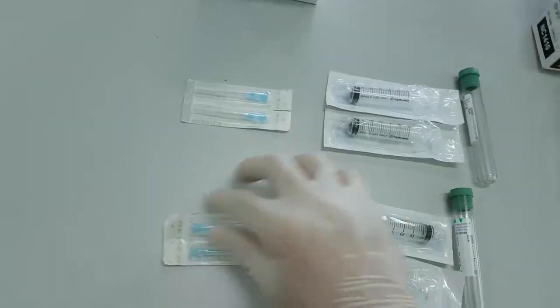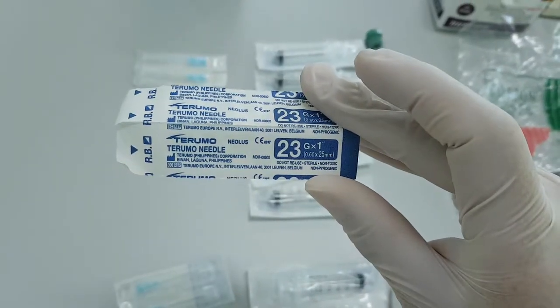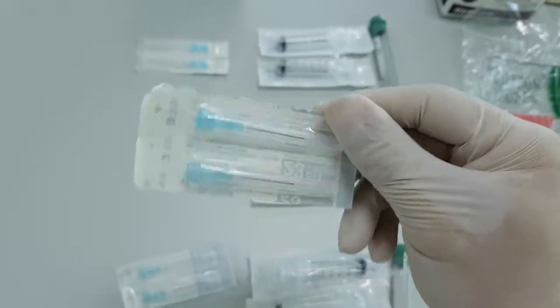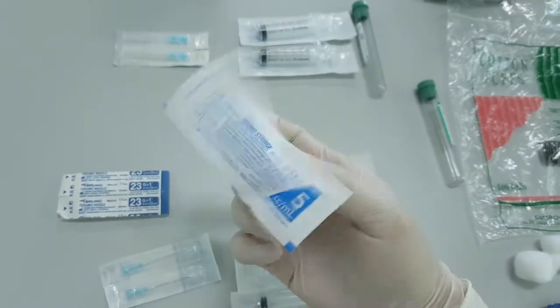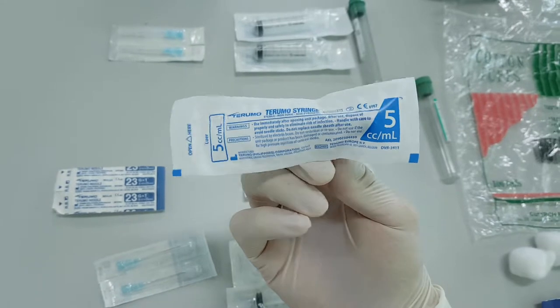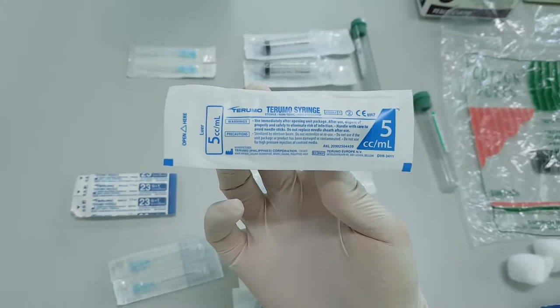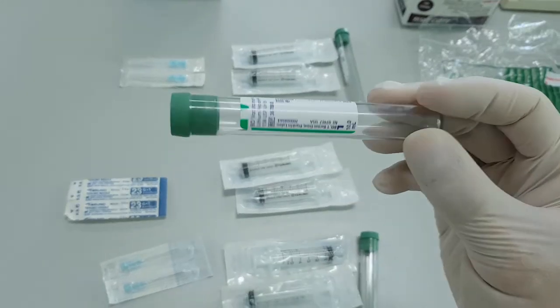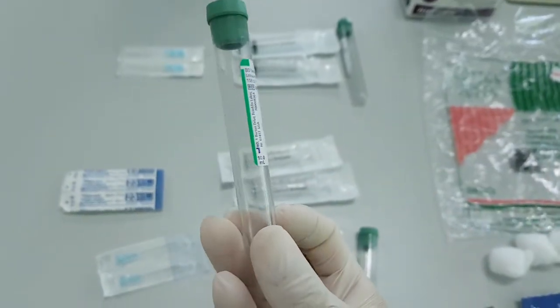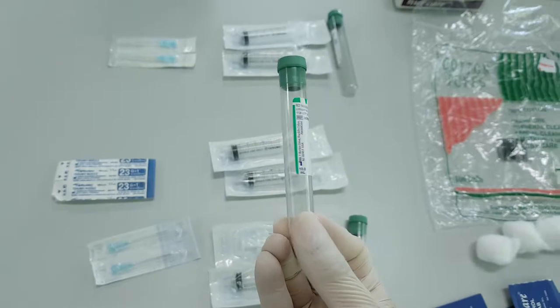For the syringe and needle, the needle will be 23 gauge and 25 millimeters — this size is suitable for the rabbit. The syringe is 5 milliliters, but if you are not used to collecting blood, the smaller 3 milliliter one will be easier. I'm using the 10 milliliter heparin tube, so I need two shots to fill one tube, but with the 3 milliliter syringe you will need three shots.